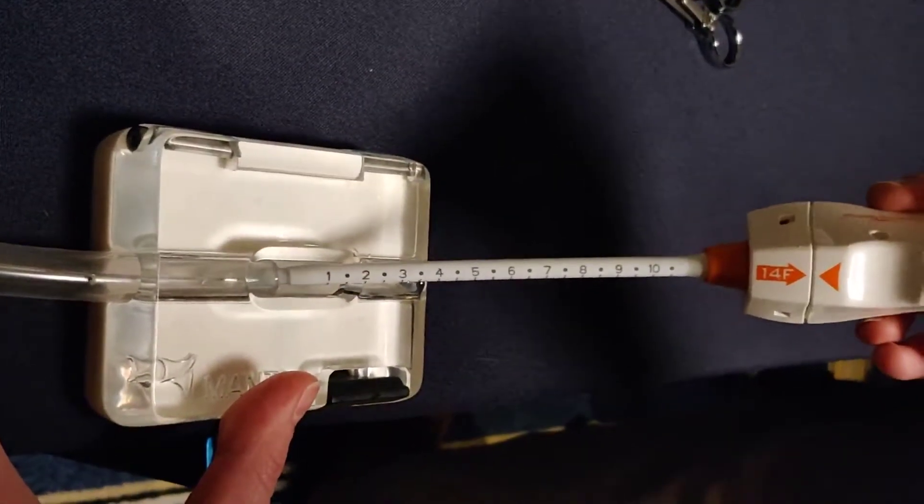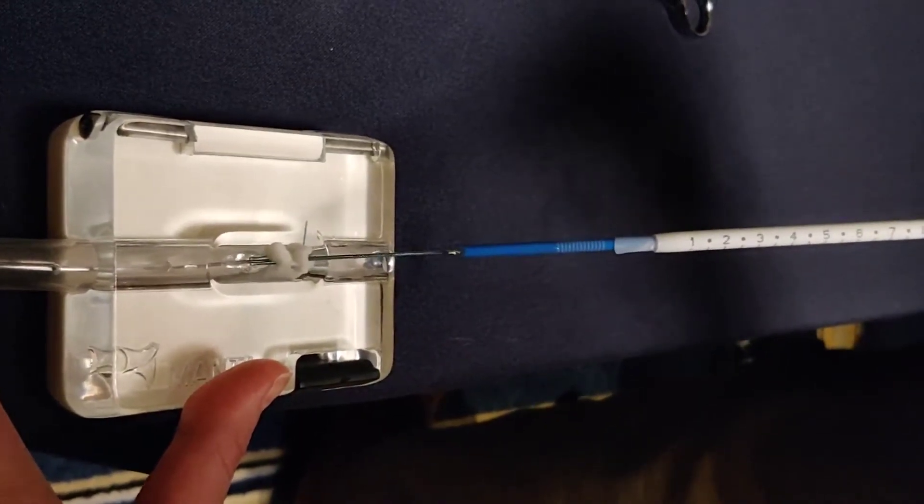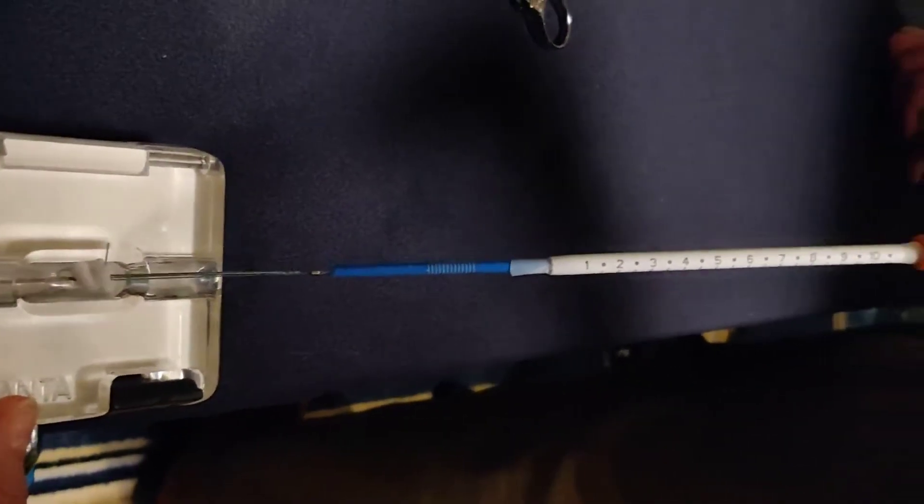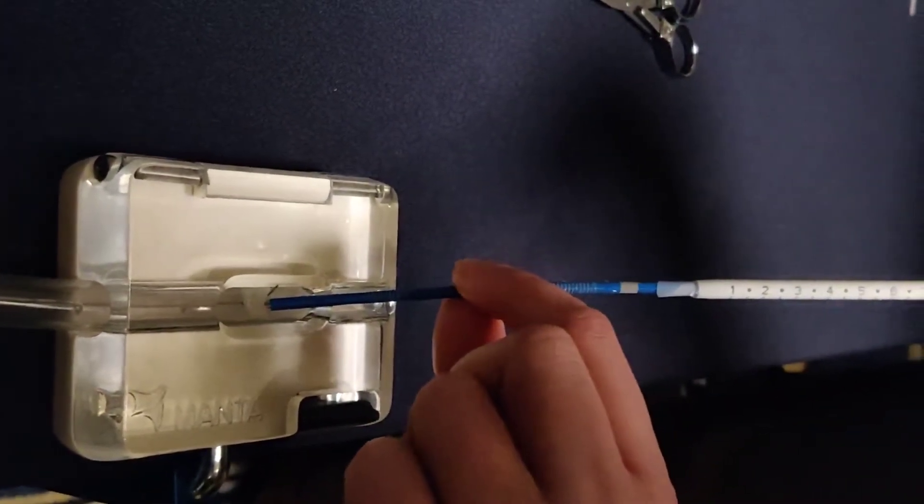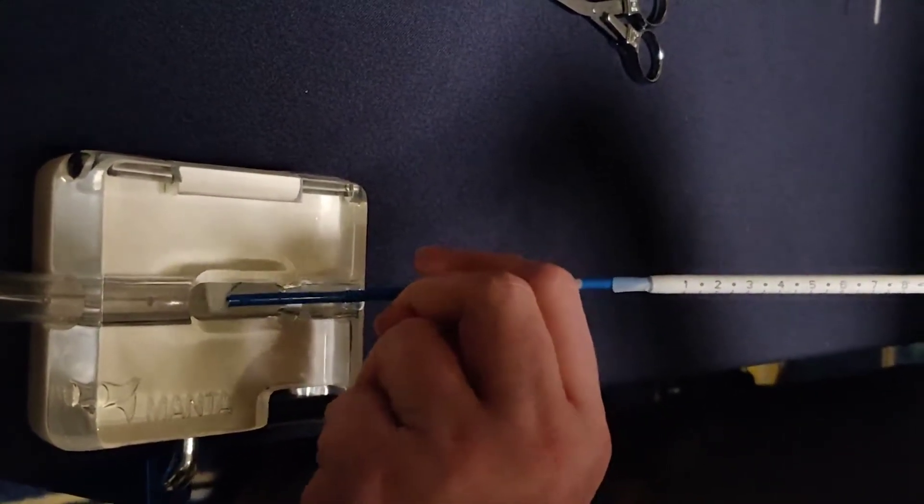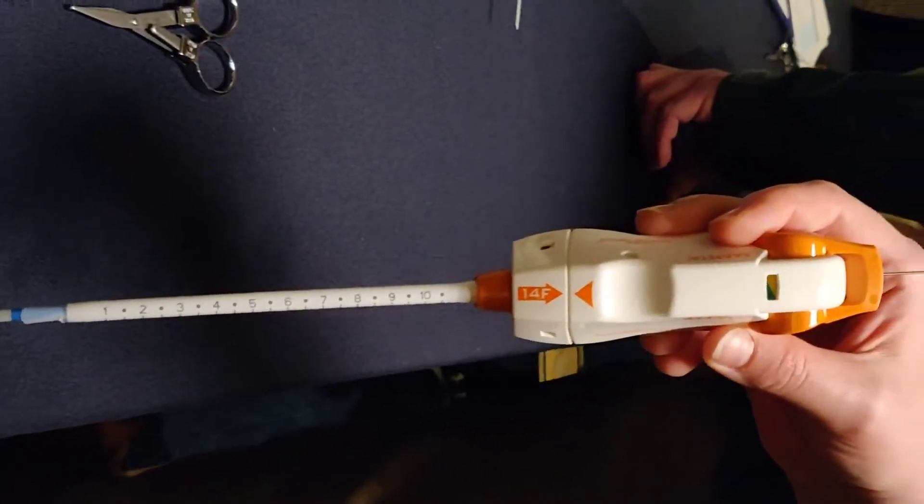Yep, now we want to go real steep, 45-degree angle, and focus your eyes right on that window. I got your wire, no worries. Perfect. Yep, so now we're gonna bring that down. When you feel that resistance, we're gonna pull to that green click.